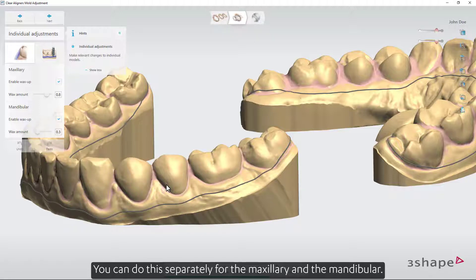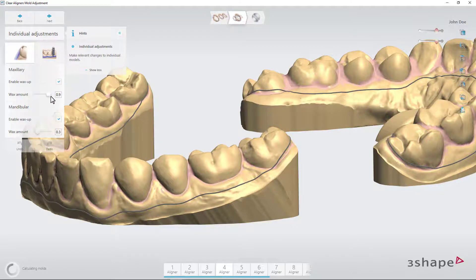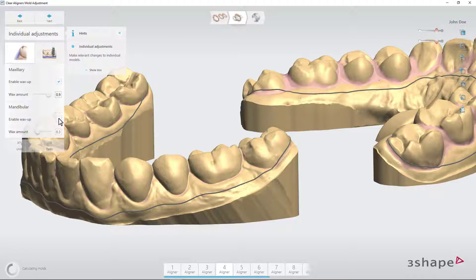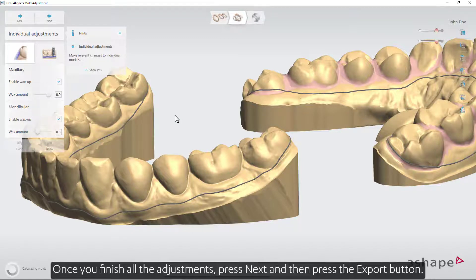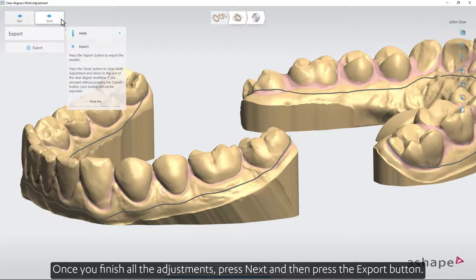You can do this separately for the maxillary and the mandibular. Once you finish all the adjustments, press next and then press the export button.